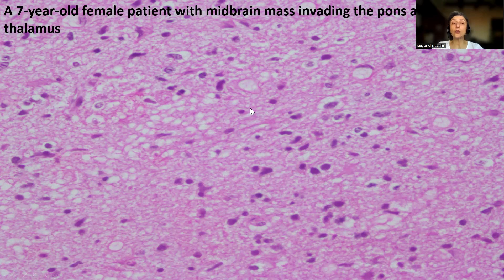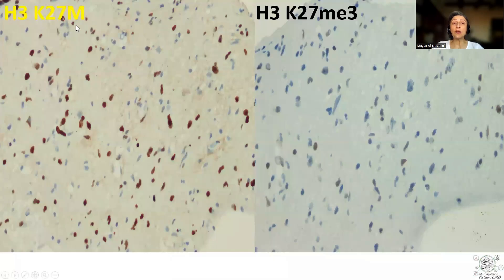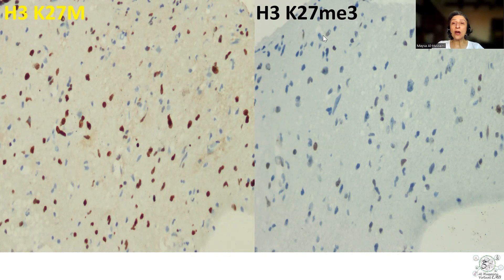Let's see how the stains help us in this context. The H3K27M shows positive nuclear staining in the tumor cell nuclei in the presence of a negative internal control — the endothelium as well as the pre-existing standby glial cells — while the trimethylation shows negative staining in the tumor cells in the presence of a positive internal control. Together, both support the diagnosis of diffuse midline glioma, H3K27-altered, WHO grade 4, regardless of the histologic grade.